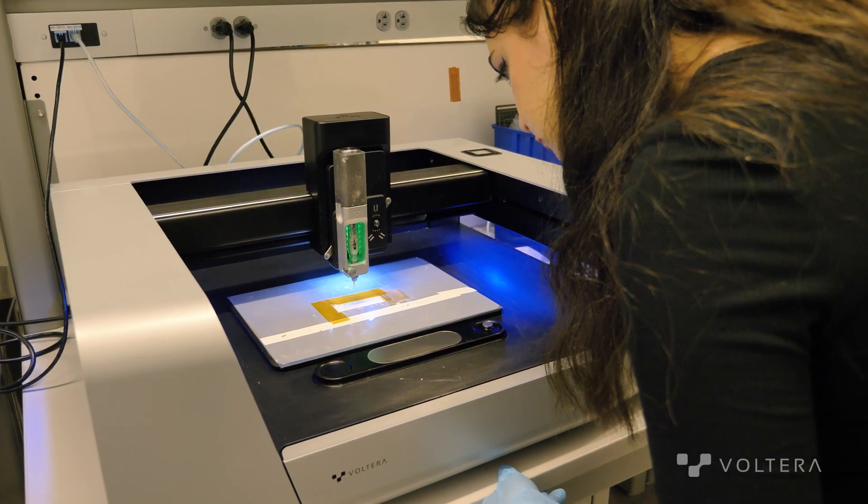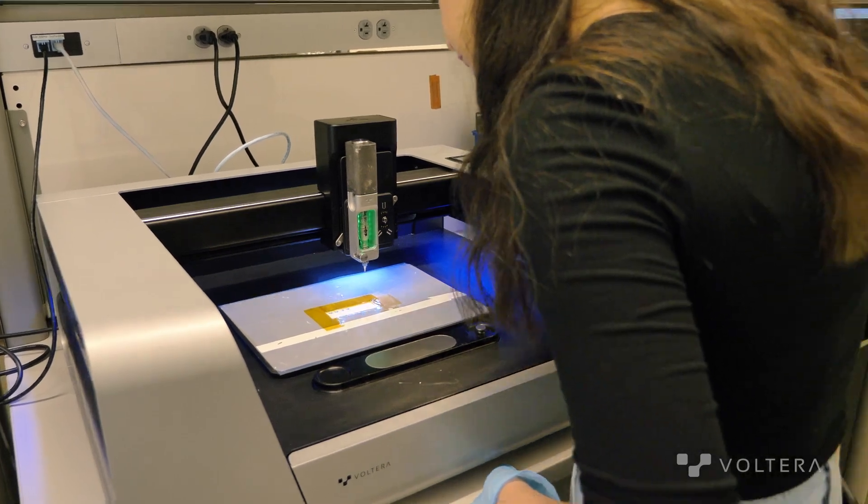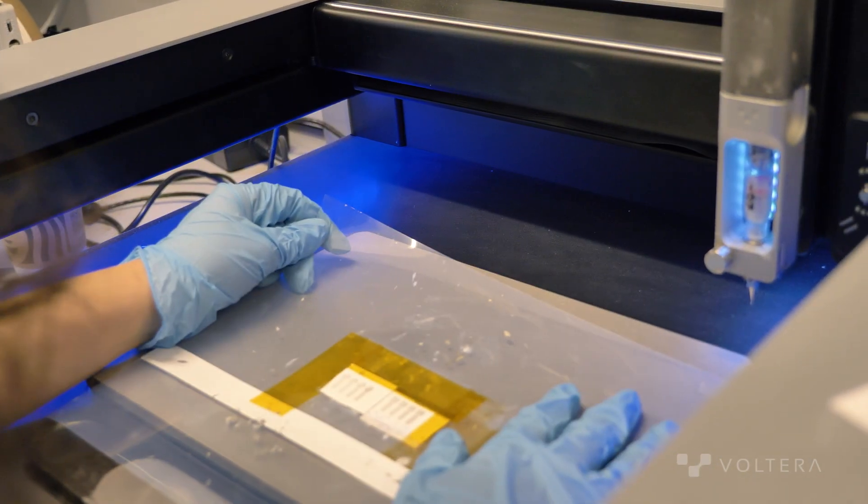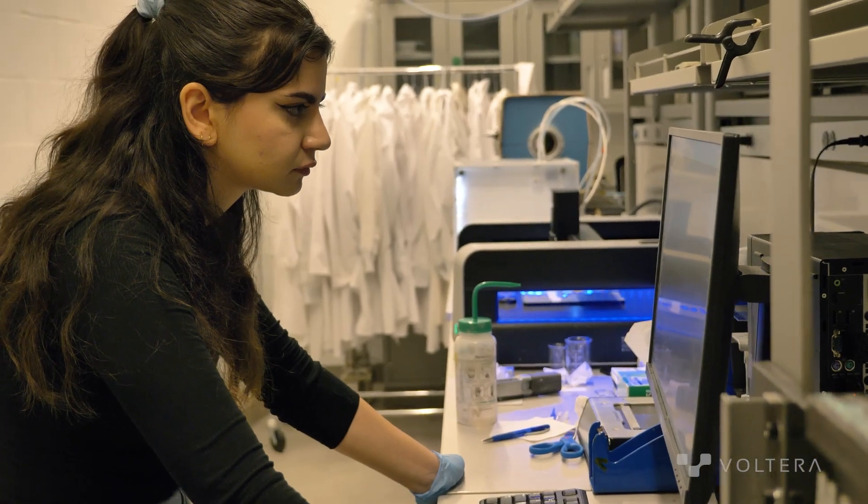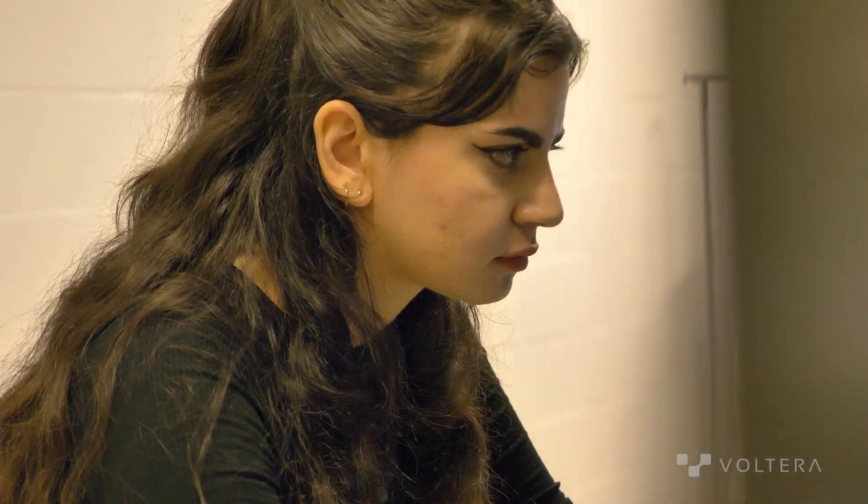Once you know how to use Eagle, you can print pretty much any design. In terms of the printing process that I would follow for developing the tattoos, initially I have my substrate, which in this case is the tattoo paper. I have that prepared and cut out, and from there I literally just follow the steps in the Nova program.